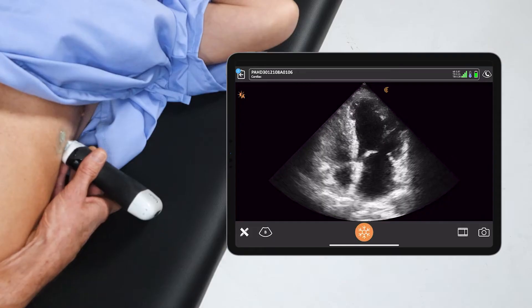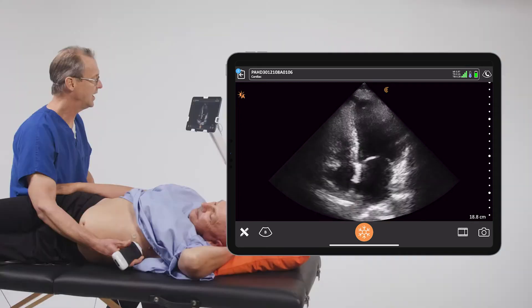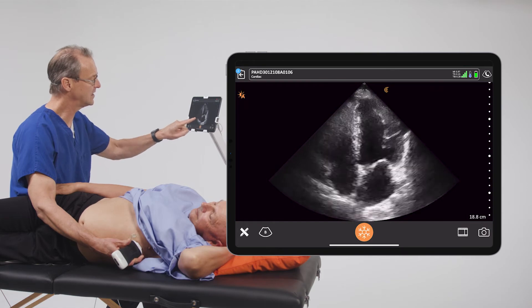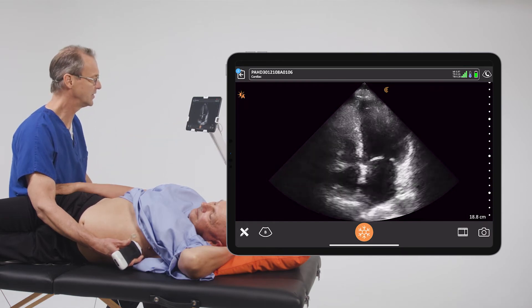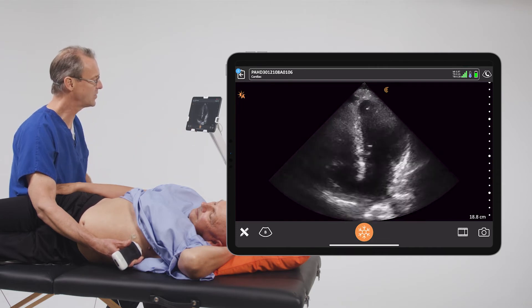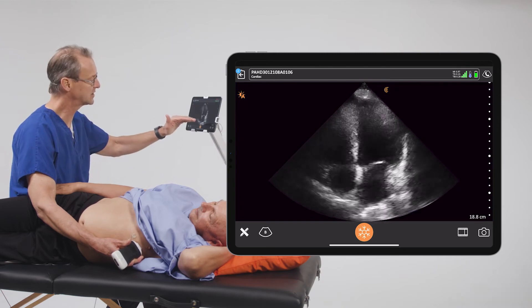To do this, you need to get an apical four-chamber view. What we need to focus on is the mitral valve, and in particular the annulus around the mitral valve. The annulus is a fiber structure that sort of holds the valve into place, and we need to focus on the lateral aspect of that annulus and measure its movement as it goes through the cardiac cycles.